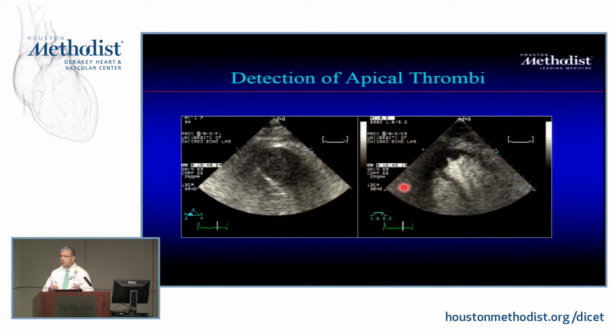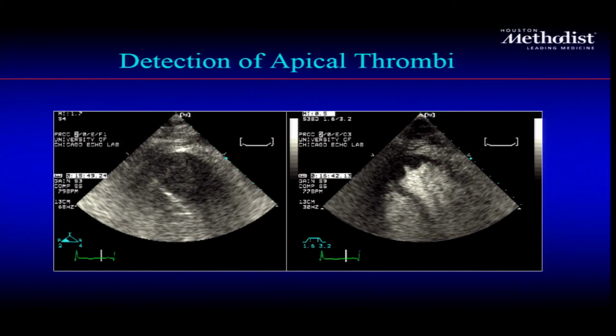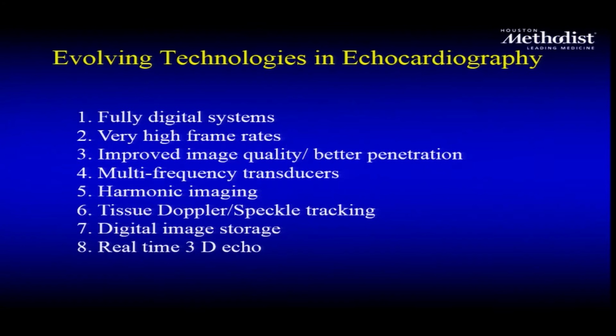And if you're really not sure of what it is, is there a thrombus, is there something hiding, you have to change your angulation so you get away from these reverberations that you have, or you could use contrast to try to improve it. Here you go, on the left side, that's the same case. There was some suspicion that there may be a thrombus here. We didn't know that it was real. Use contrast and it improves the situation.